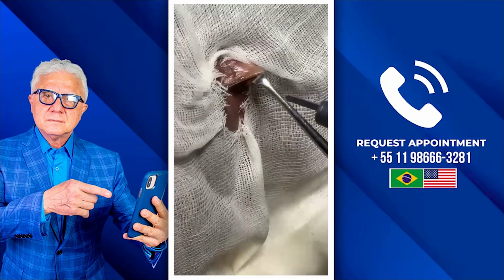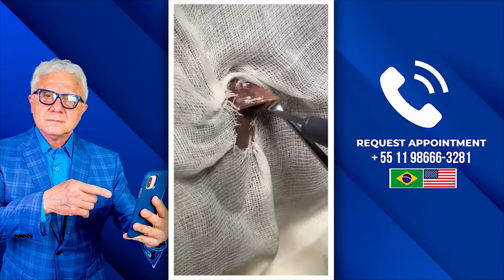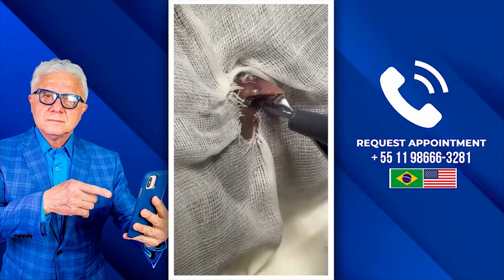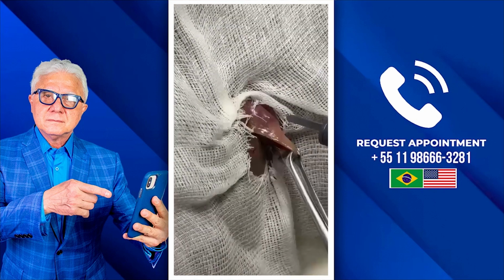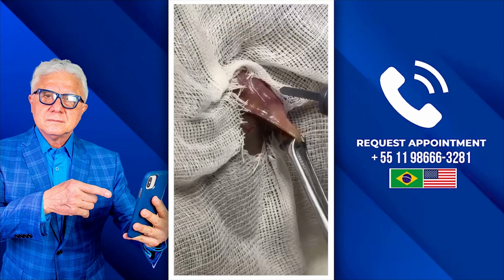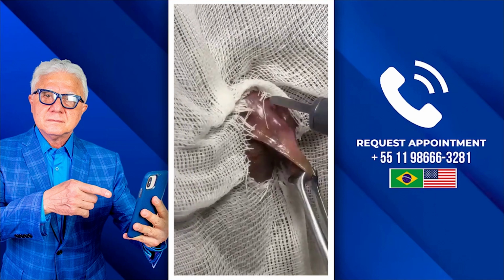You are seeing a hemorrhoid. Look, the hemorrhoid is at the tip of my forceps. Here is the hemorrhoid, see? This is a hemorrhoid. This is a grade 4 internal hemorrhoid. It has both vascular and skin components. At the tip of the laser, I'm showing you.